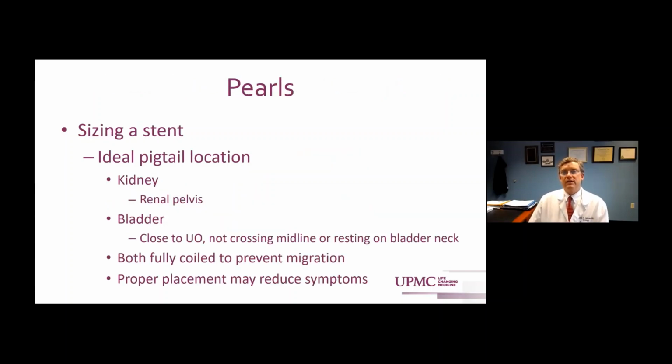So we're getting to the last few minutes, and I want to move on quickly to a couple of pearls. One of the things we never think about is why we do it in many ways: how do we put a stent in properly? How do we size a stent? There are at least 100 ways to do that, and I think everyone's learned a way, but we like to come up with ways that are reproducible, and I have a number of things that we do in that manner. And one of them is putting in a stent.